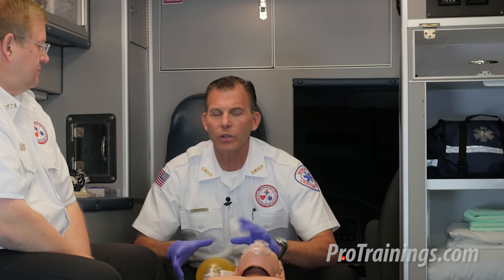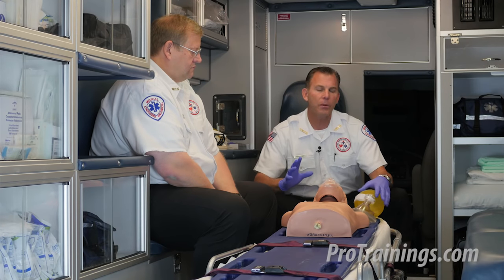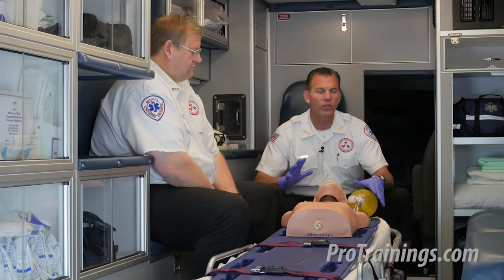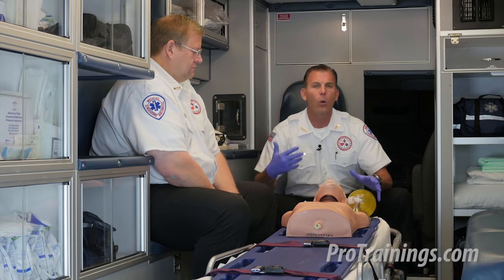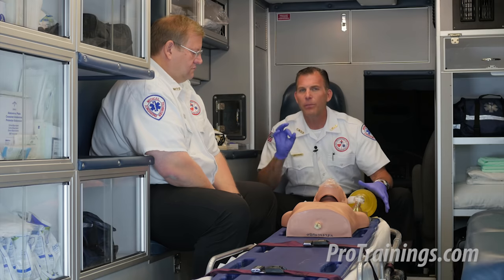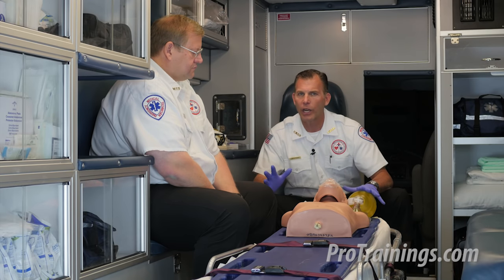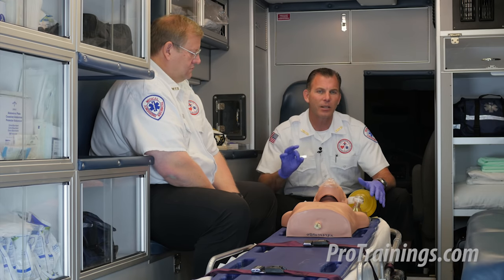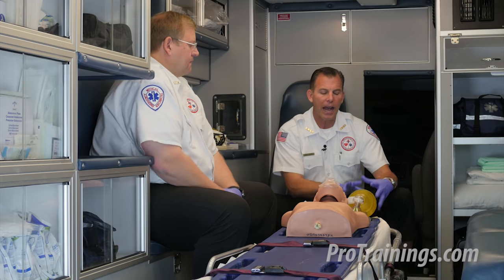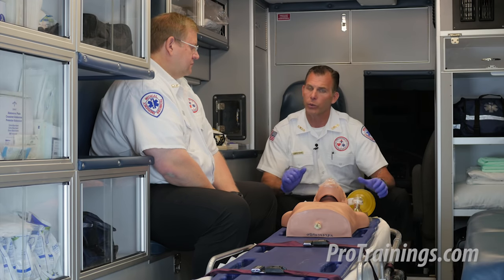Now let's cover the particulars of the bag valve mask. It's important for us to talk about several aspects — without deliberating too long — about why we would use a bag valve mask, what it is for, and some pitfalls we can accidentally get into if we're not aware of what to do with it or how to use it properly. I'll go through them systematically and explain how we use it, why we use it, and what adjuncts we use it with.